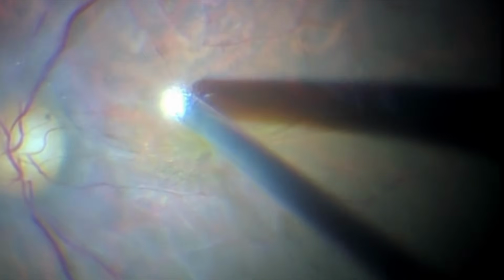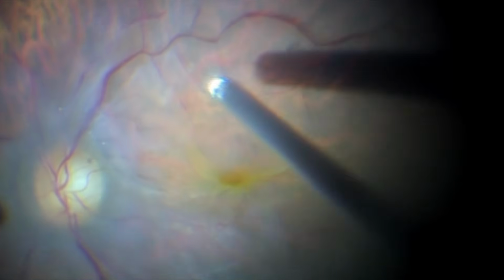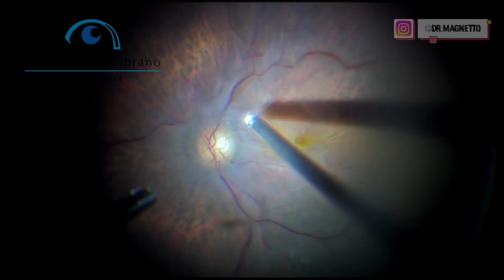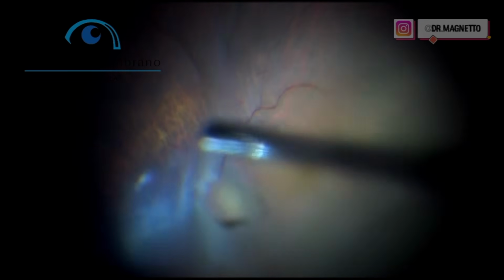After isolating, he performs the typical maneuver for detaching the posterior hyaloid, taking care to avoid possible peripheral iatrogenic breaks. The adhesions along the vascular arcades are firm and usually require very controlled movements at this stage.